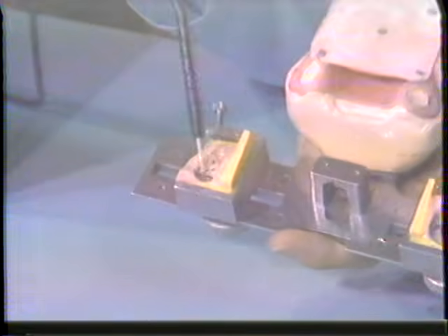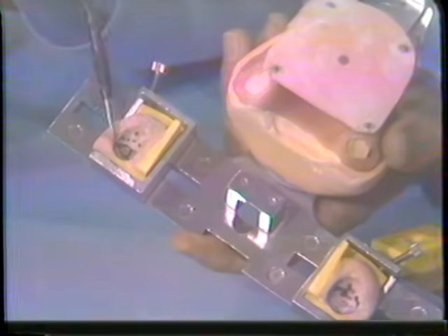After mounting, again, plastic is placed in these elements on each side, and the opposing members in the instrument are moved about, and you trace out the actual paths made. Now this simulates the paths created in the mandibular fossa. It's a rather ingenious instrument.